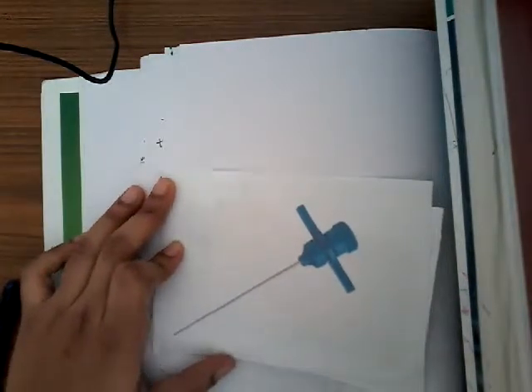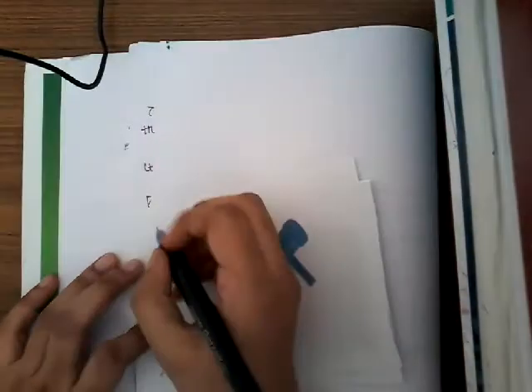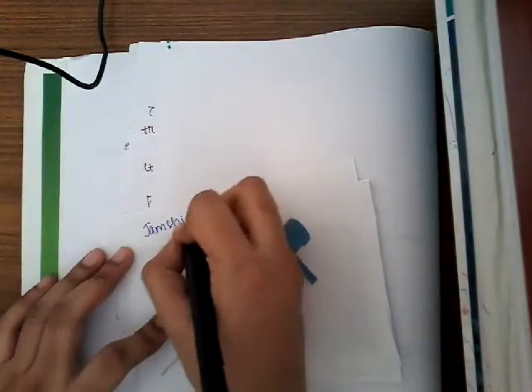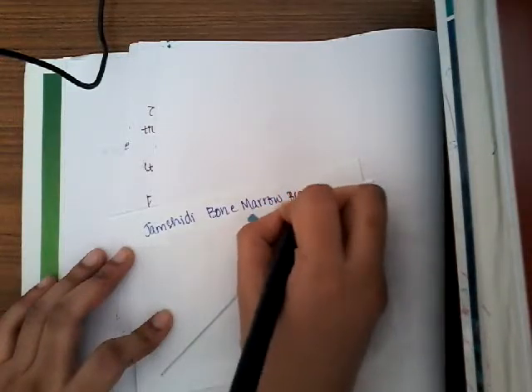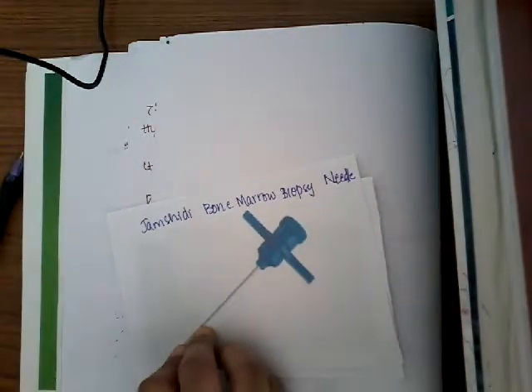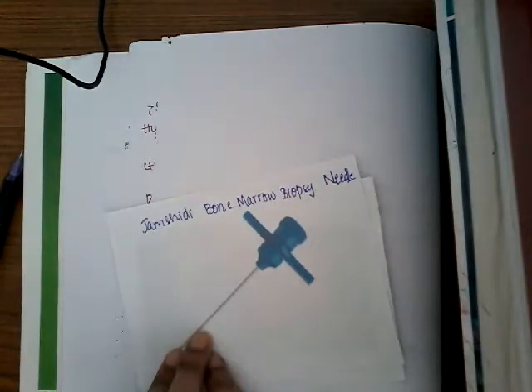Hello friends, welcome to a new lecture today on bone marrow biopsy, needle biopsy, or bone marrow aspiration. This needle which you see here is the Jamshidi bone marrow biopsy needle. We will first learn about the indications for bone marrow aspiration and then learn how bone marrow biopsy is done.